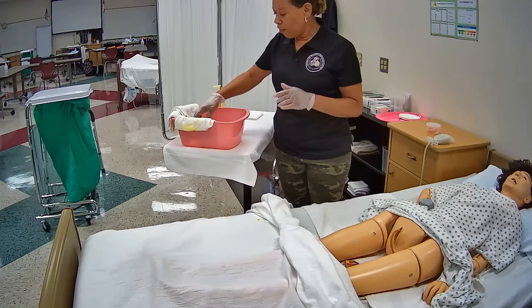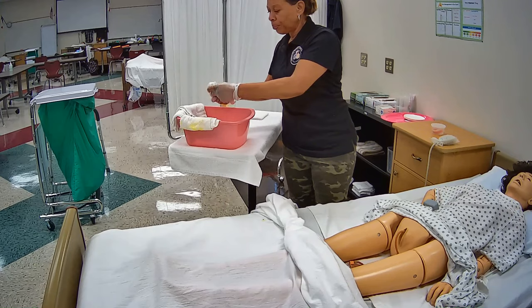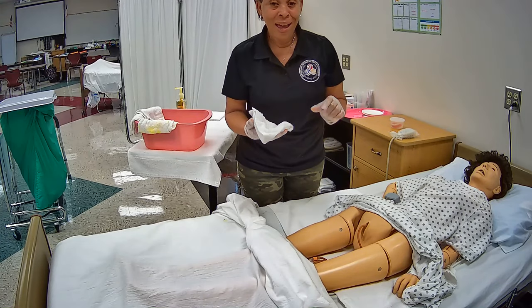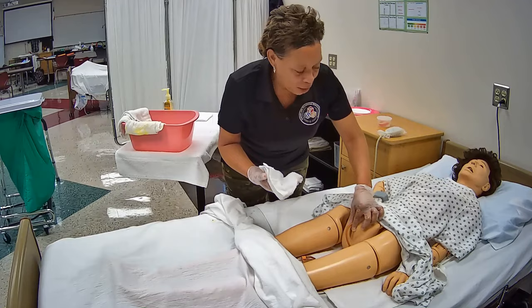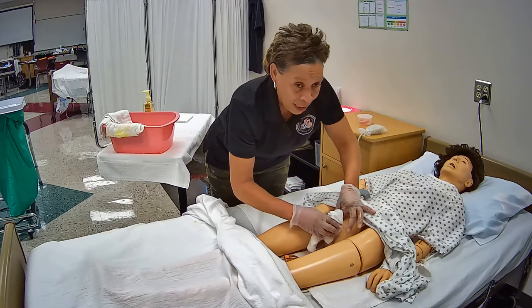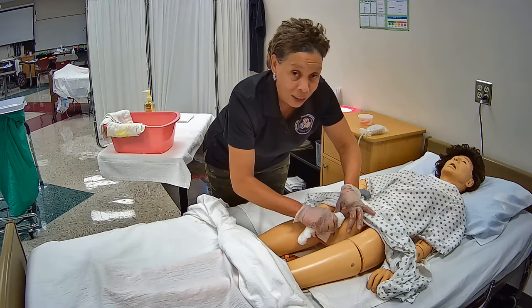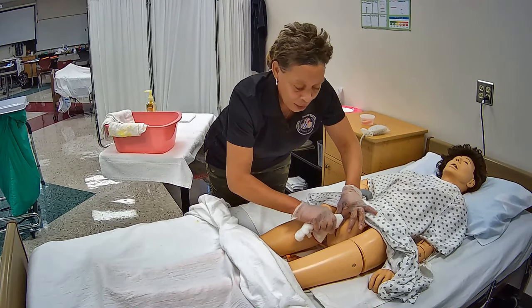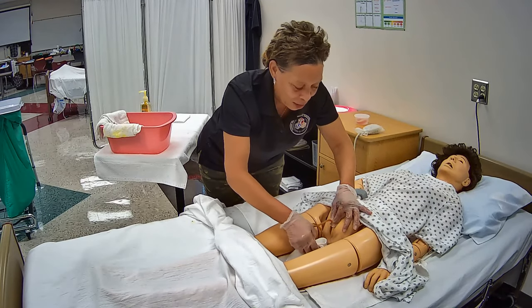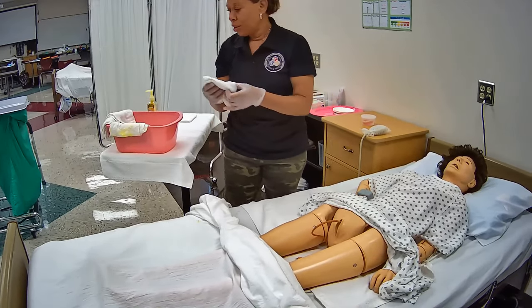The fourth washcloth I'm going to take and wet. I'm going to squeeze out all the water and not put soap on it. I'm going to use this washcloth to rinse the catheter in the same manner that I washed it. Mrs. Jones, I'm just going to rinse your catheter now. Again, I'm holding it as close to the meatus without tugging or pulling it — your fingers should be touching the person. I'm going to wrap the washcloth completely around the diameter of the catheter, gently rinse the entire length, then place it on the linen protector and release the catheter from my hand.